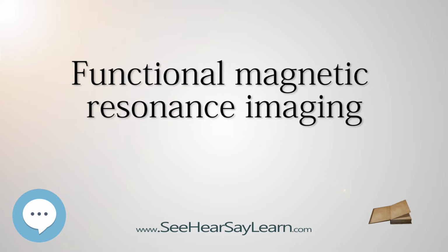The BOLD response can also be affected by a variety of factors, including disease, sedation, anxiety, medications that dilate blood vessels, and attention, neuromodulation. The amplitude of the BOLD signal does not necessarily affect its shape. A higher amplitude signal may be seen for stronger neural activity, but peaking at the same place as a weaker signal. Also, the amplitude does not necessarily reflect behavioral performance.